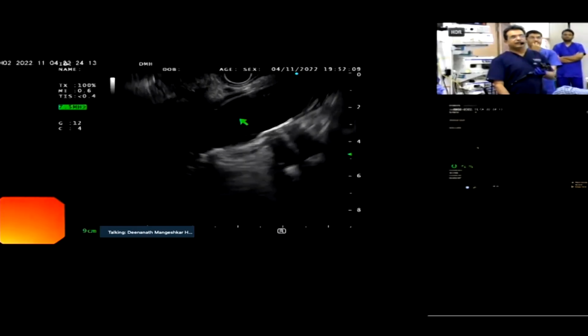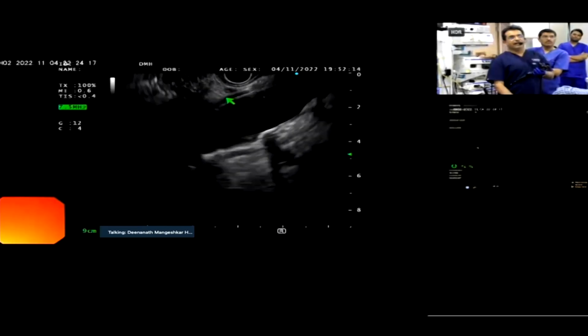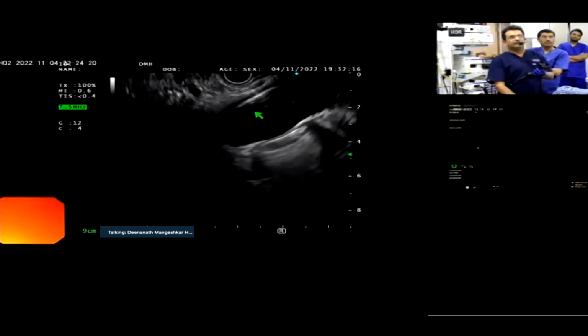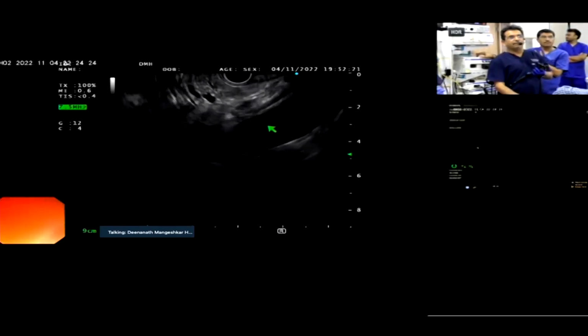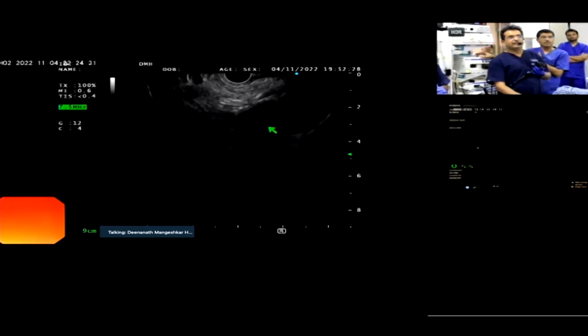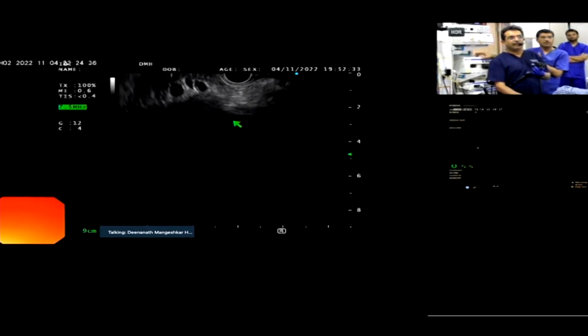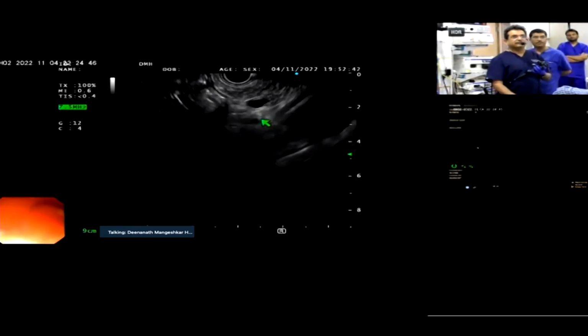Now, you can see the crest of the diaphragm right on top of the aorta over there. Yes, and now I will follow the aorta downwards as it enters the abdominal cavity. And now we try and look for the celiac artery take off. Sometimes it is not dead in the midline, but here you can see the celiac artery take off. And distal to that, you will also see the SMA very often. Yeah, you see the SMA, that's the celiac. And that is going to point you to your pancreas. So this is where your pancreas is.